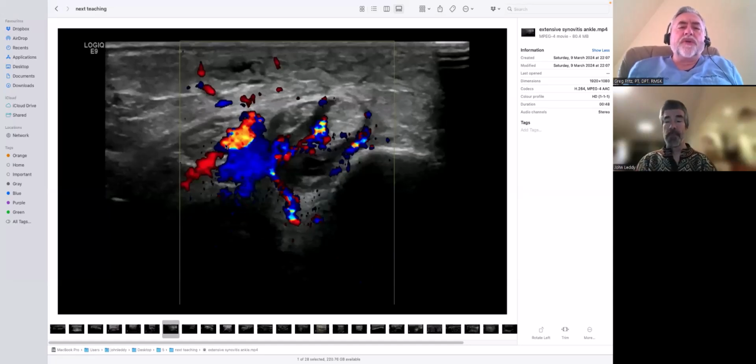And how long will you hold the view? Not very long. No, 3 to 5 seconds? When the spirit moves you. Yeah, well, you have a look. I don't measure it. Some of the scientists come back and say, well, you have to wait for the flow to come. I say, well, if that's the case, why do I see it when I'm scanning through? Yes. So on your modern kit, it doesn't take very long, and if you're going to see the flow, what's important is that you're not pressing.